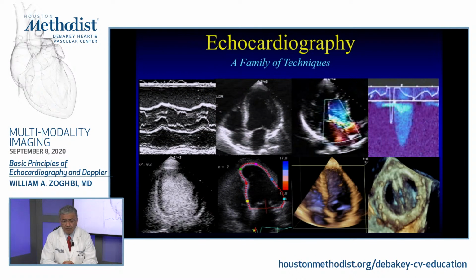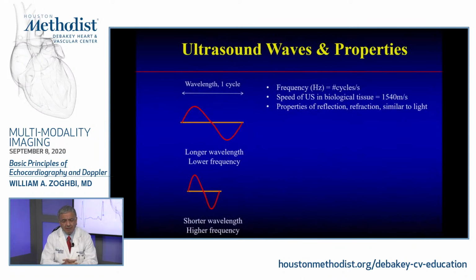So echocardiography, for most of you, is really a mature technology that has evolved into techniques from M mode to 2D, 3D echocardiography, and the various Doppler evaluations that we have to deal with. And I think each one of them is amazing in a way, because all of them depend on these small packets of ultrasound that are sent. They reflect back to us, and then we ask the question: how far is it? How intense? Did the frequency change when we send it back? And these are the basis of imaging and ultrasound.